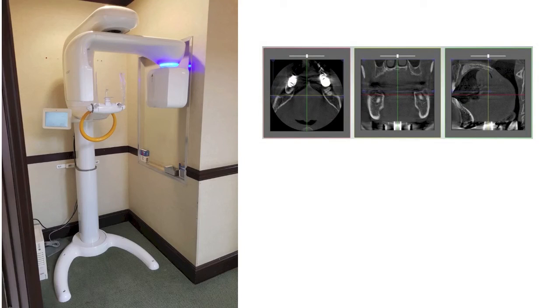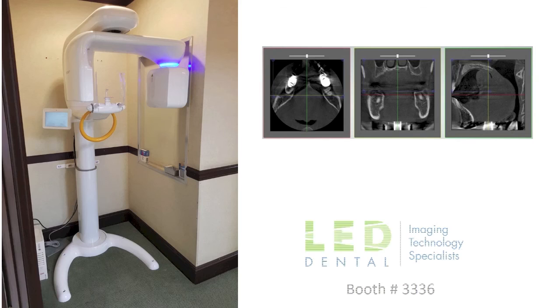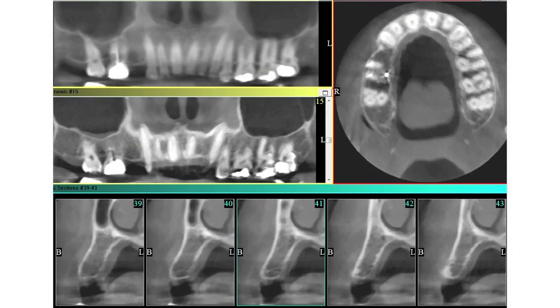These are the images that are initially produced. It produces what's called DICOM data. That's a standard format that all the cone beam CT machines and all the medical grade CT machines produce. After the DICOM data is made, reformatting software reformats it, and this is what we're normally used to looking at. If you're doing any implant treatment, these are the kinds of pictures you see. But it comes from the DICOM data.